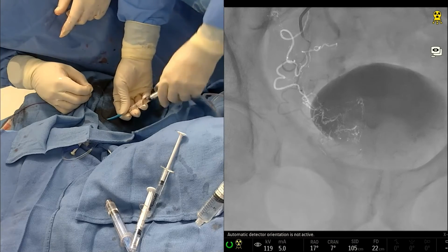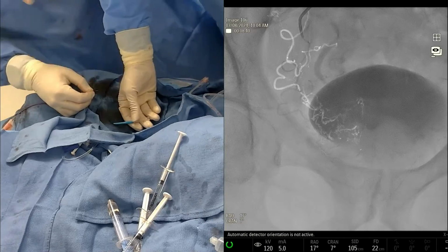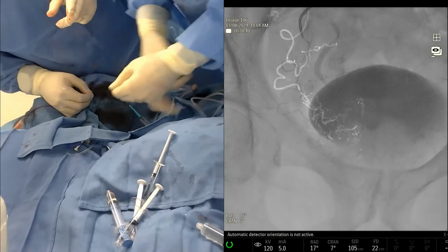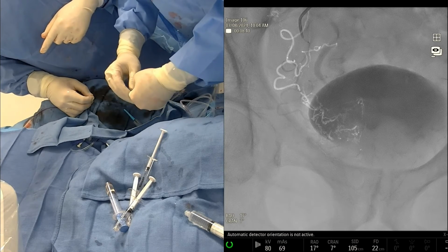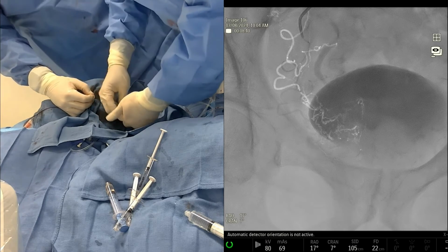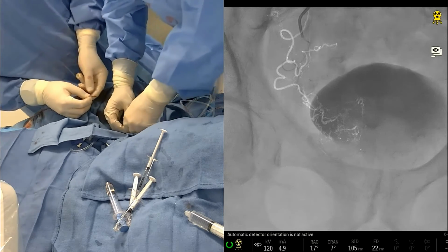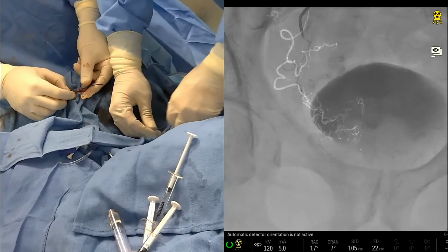We're still going into there. Why don't we keep going? I think we should go a little bit more distal. Yeah. So the difference with a balloon and an end hole, and we talked about this before, Viv, is that we want to go more distal without the balloon because we're not going to be able to penetrate as deeply without the balloon. And so one of the tricks is to take the base catheter and proximally almost try to create spasm in the proximal prostate artery with that catheter, so you almost create your own balloon occlusion.